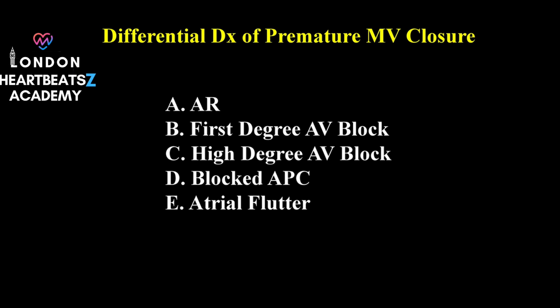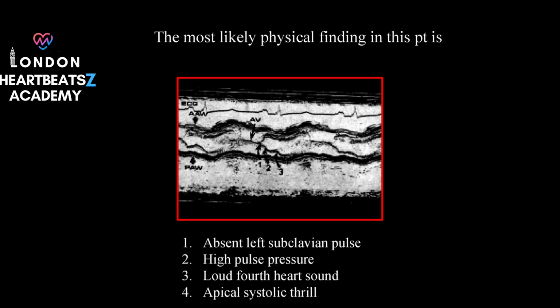One of these intriguing cases involves aortic regurgitation. It's a condition where the aortic valve, which controls blood flow from the heart to the rest of the body, doesn't close tightly, allowing blood to leak back into the left ventricle. Ah, so it's like a leaky faucet, but in the heart. Exactly. That can't be good. What does M-mode show us in this situation?